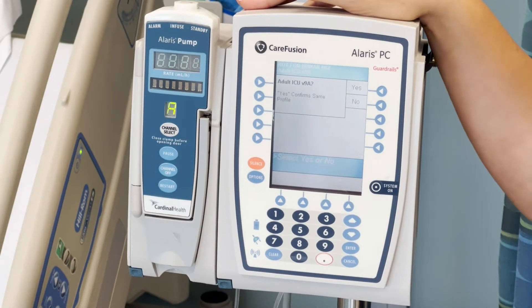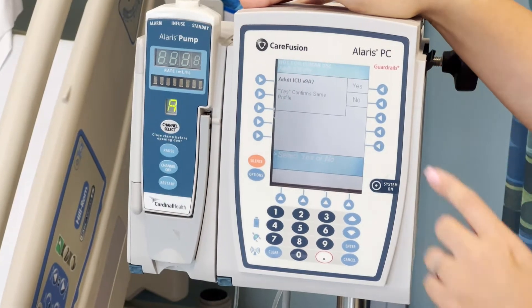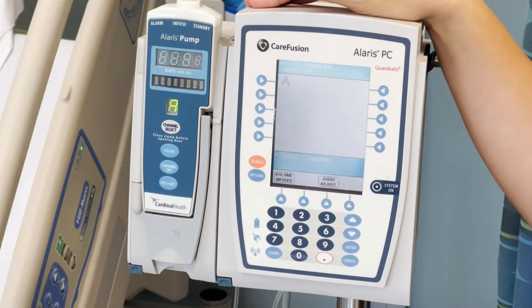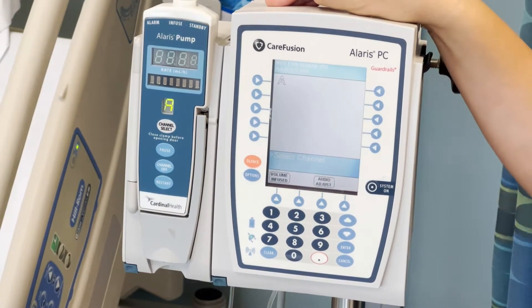Next, it asks what location you're in. This will determine what medications you have available through the guardrail system. I'm going to say yes, we are in the ICU. That will give me a much bigger directory of medications that I am allowed to give because I'm in the ICU.